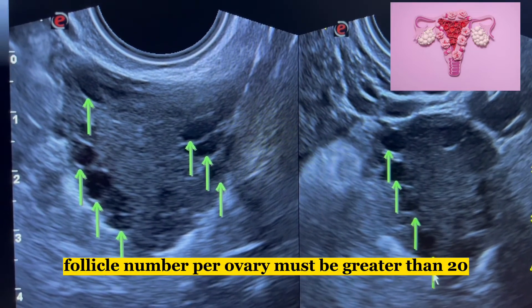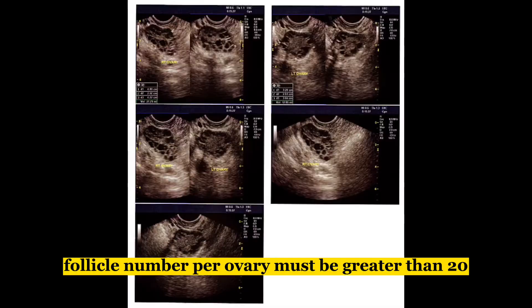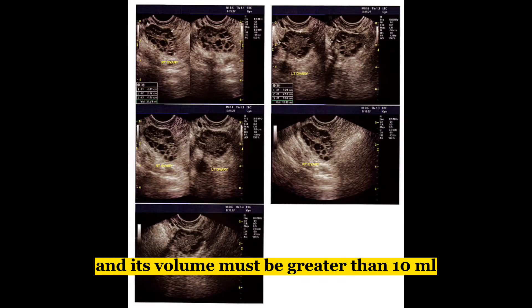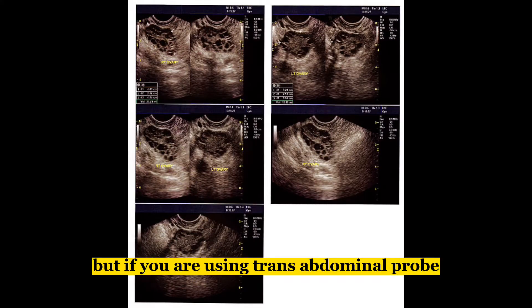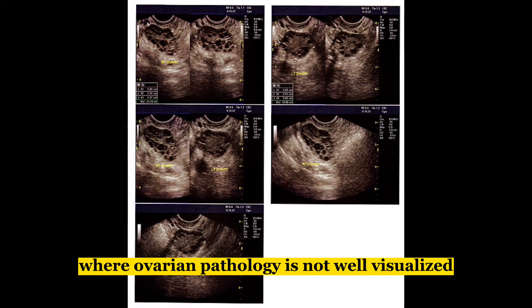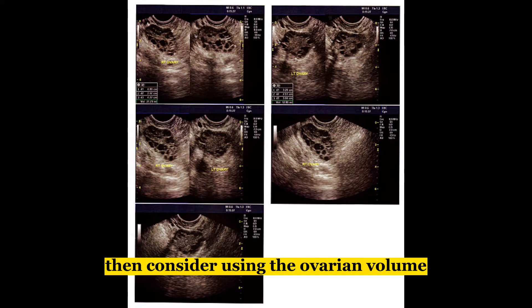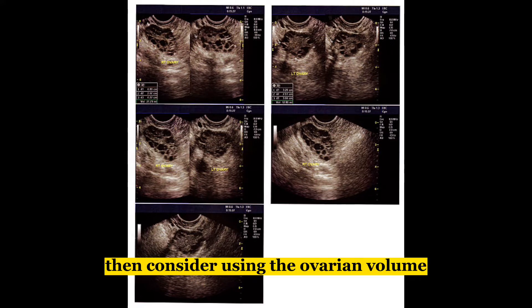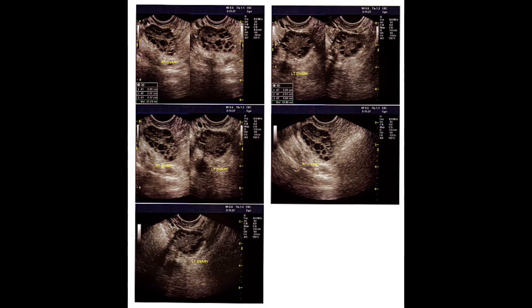Follicle number per ovary must be greater than 20 and its volume must be greater than 10 milliliters. If you are using a transabdominal probe where ovarian pathology is not well visualized, then consider using the ovarian volume, which must be greater than 10 milliliters.